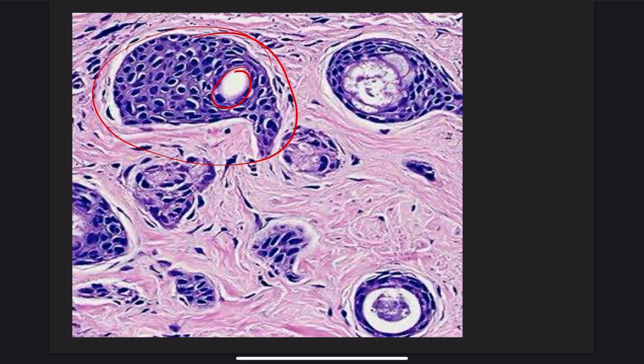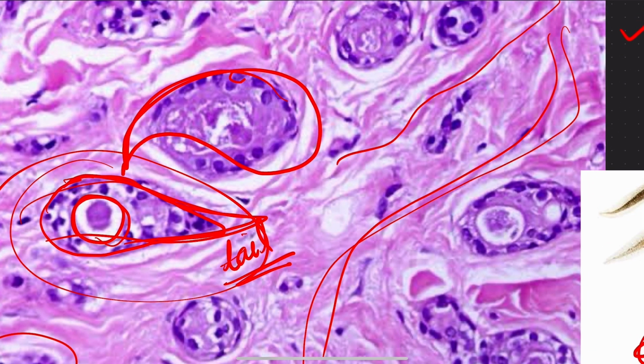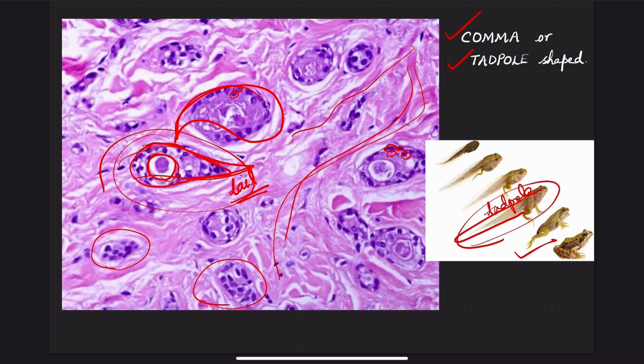The cells are basaloid. Basaloid cells means, like the lowermost layer in the epidermis, they have densely basophilic cytoplasm and a very dense nucleus. All these basaloid cells form this nest. Also, in a few of the ductules, you can observe two layers of epithelium, two rows of cells.